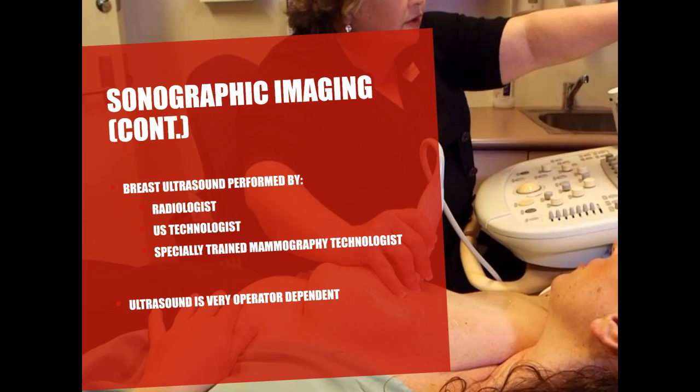So the breast ultrasound is going to be performed by either the radiologist, an ultrasound technologist, or a mammography technologist that has had breast sonography training. And I've seen it all ways. There may be a combination of the technologist and the radiologist, and that's mainly because ultrasound is very operator dependent.